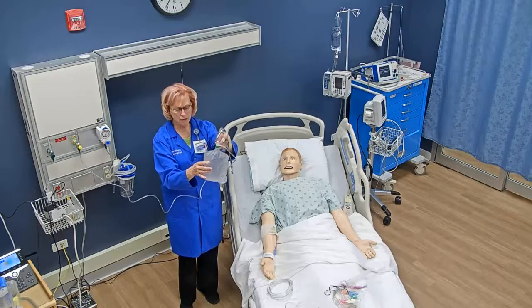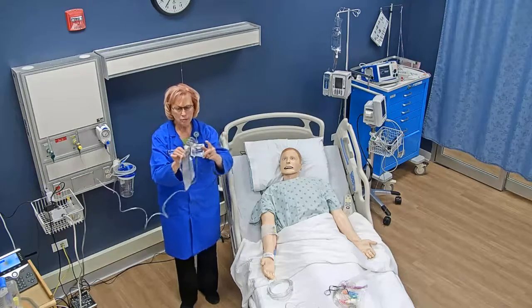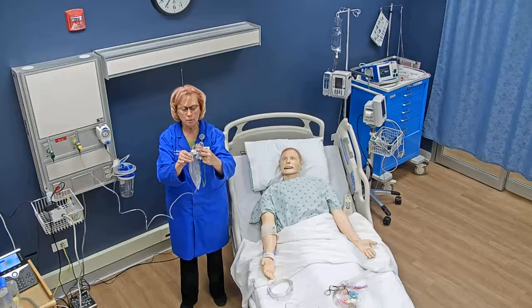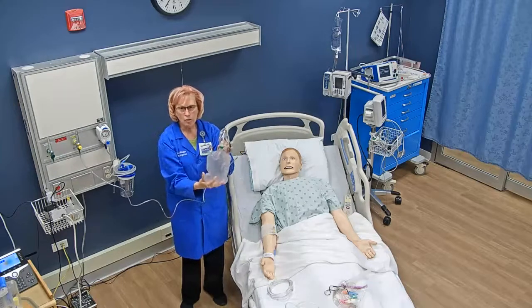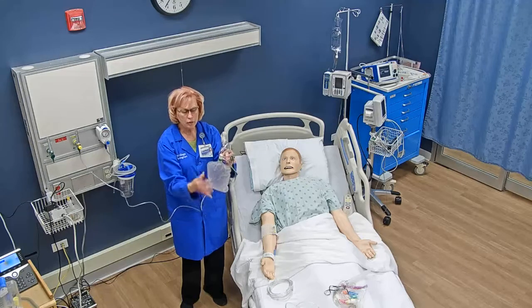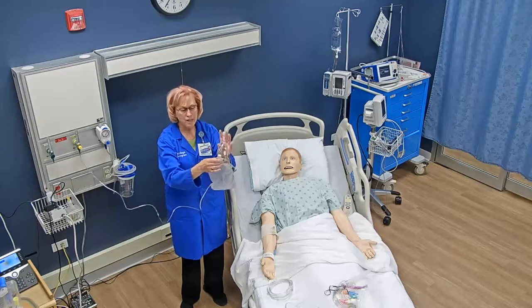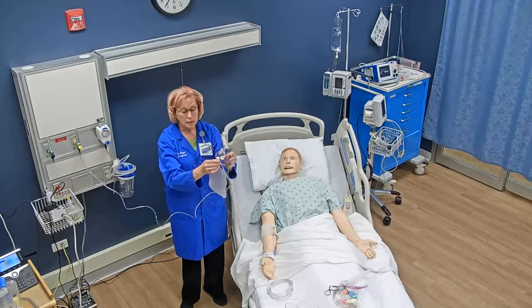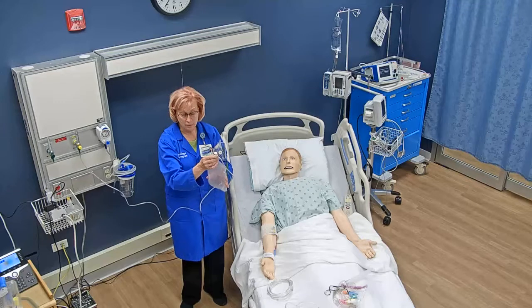Now the bag is inflated with 100% oxygen inside. When my patient breathes in, this little flange lifts up, the side vents close, and the patient breathes in almost 100% oxygen. Patients with this device will get approximately 80% oxygen — it's not airtight so they don't get 100%, but very close. I would use this for somebody who needs a lot of extra oxygen.